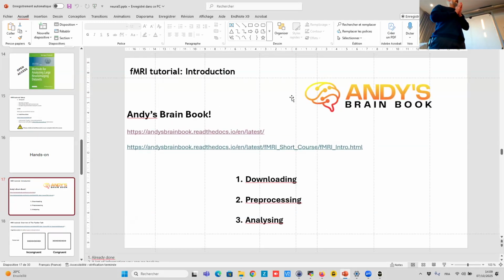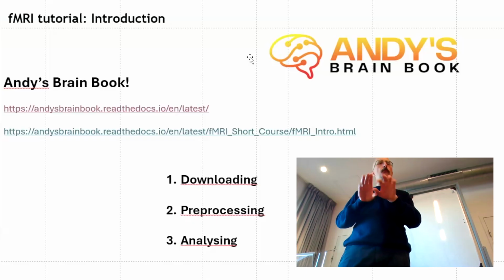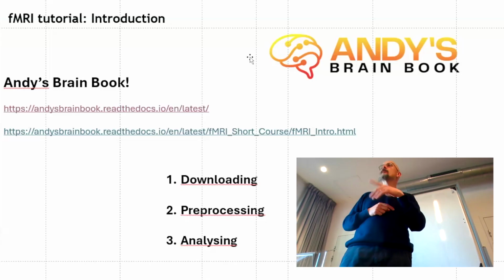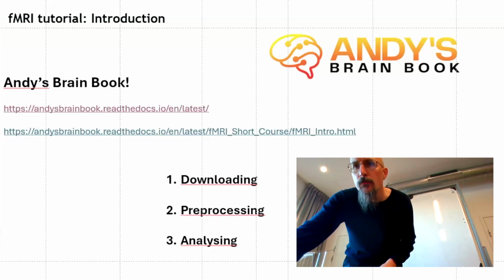So what I'm using today, quiet, please. Today I will use some tutorials that have been made by Andy, who is doing a very great job making tutorials. There is Andy's Brain Book, which is a website where you can find all the tutorials I'm going to show today. If you type Andy's Brain Book, you will go to this website.